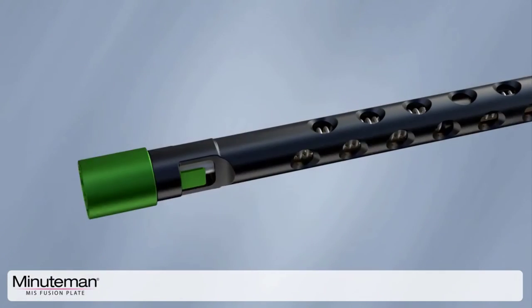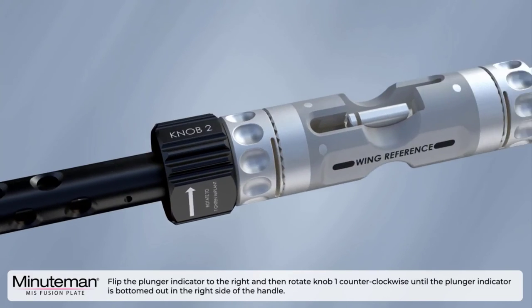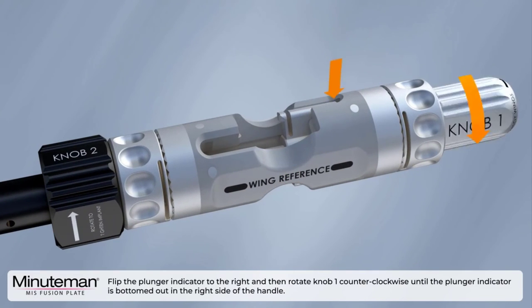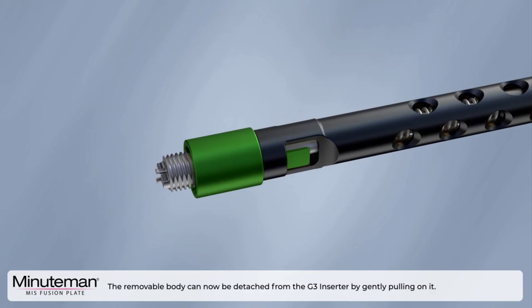Once outside the patient, retract the outer sleeve and then rotate counterclockwise to expose the tip of the inserter. Flip the plunger indicator to the right and then rotate knob one counterclockwise until the plunger indicator is bottomed out in the right side of the handle. The removable body can now be detached from the G3 inserter by gently pulling on it.